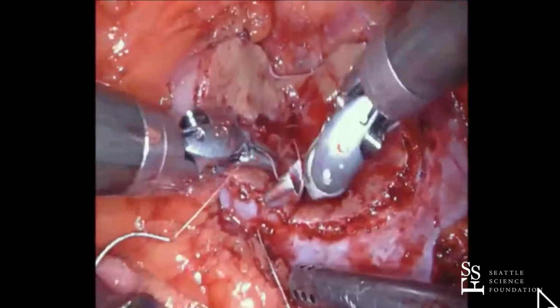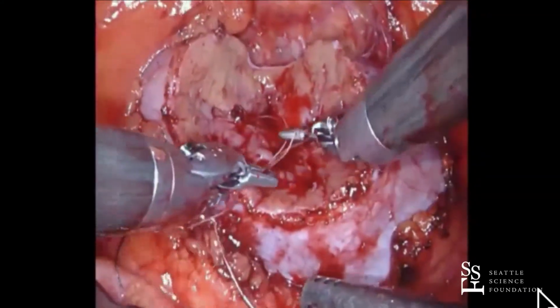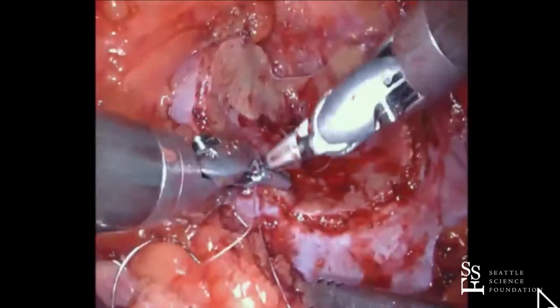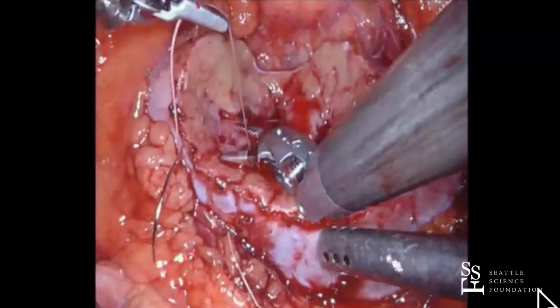Well, I wasn't doing individual vessels with the V-lock. I was doing like the whip stitch that you classically see. I just didn't like the way it worked. It does saw more. That's the thing about the V-lock. Because it has the barbs that stick out, it's going to saw more.